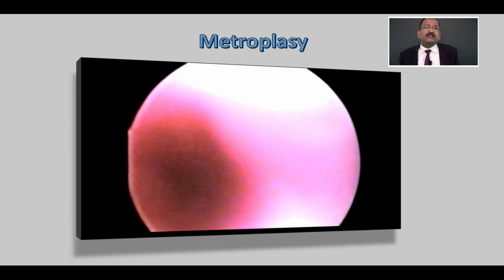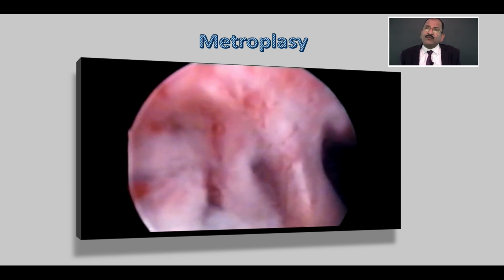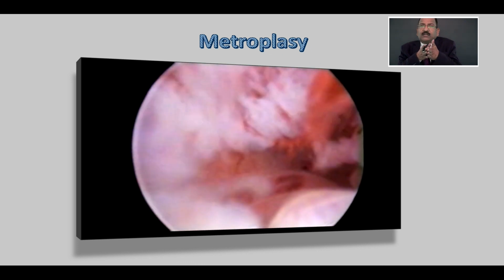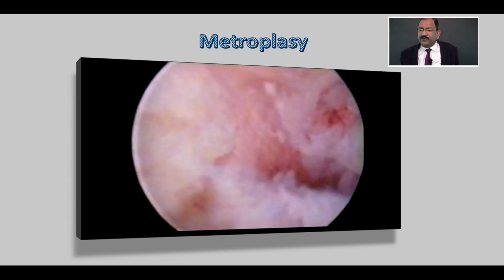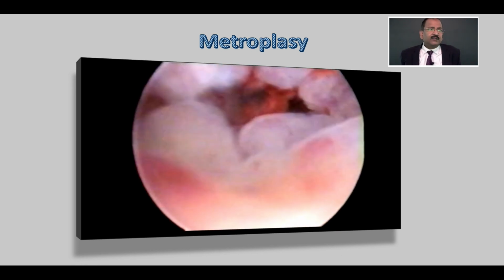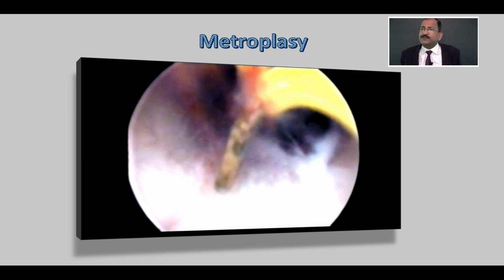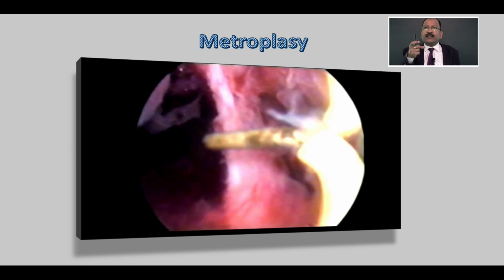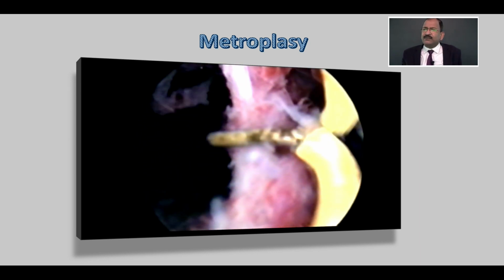Towards the cervix, it will be thin, of course. And once you go away from the cervix, it starts becoming thicker because septate uterus is like that. Towards the cervix, thin. So towards the cervix, maybe in one go you can cut it. But once you go towards the fundus, you have to go in multiple steps. So this is Collins knife. It is just like our L hook. And you can see it is very thin near the cervix.